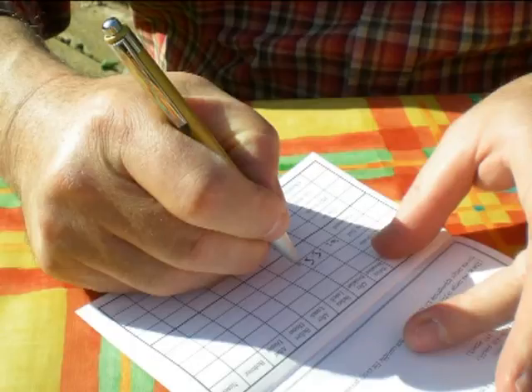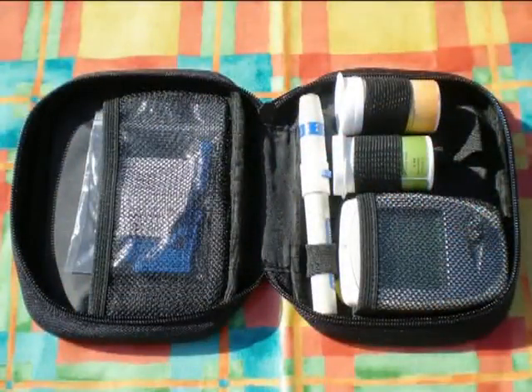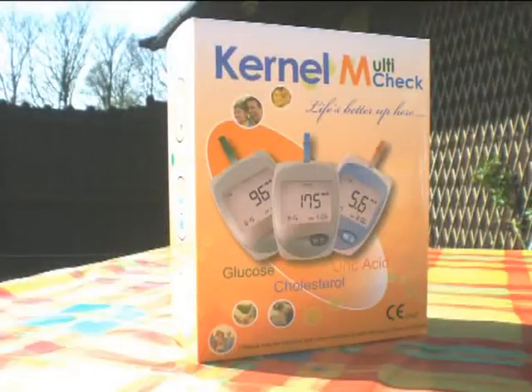The meter automatically keeps track of the last 100 tests you do, however it is always good to keep your own record as well. Once you have finished, pack everything back into its convenient storage case ready for the next use. The amount of times you take these tests is personal to you. Many people take the test regularly until they build up a pattern, and then they take the test occasionally. Of course, if you can feel an attack of gout coming on, then take the test to check your uric acid level. We hope you have found this brief guide useful.